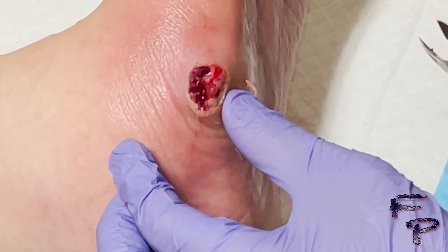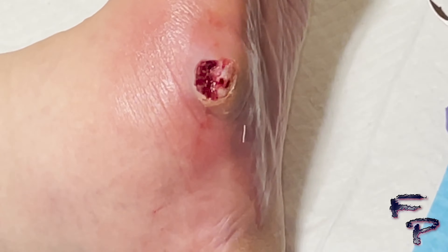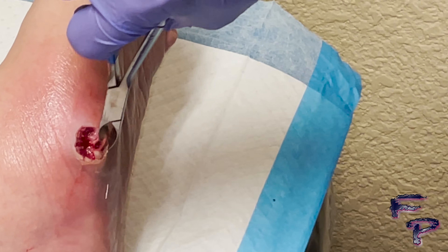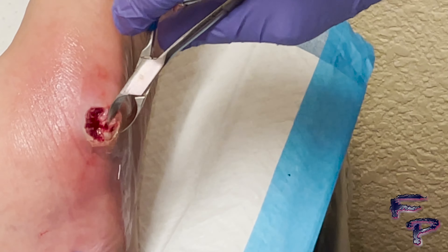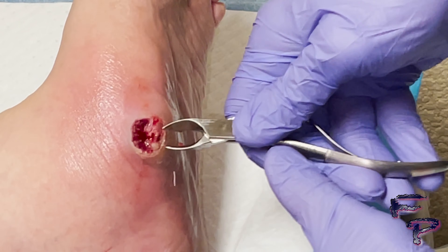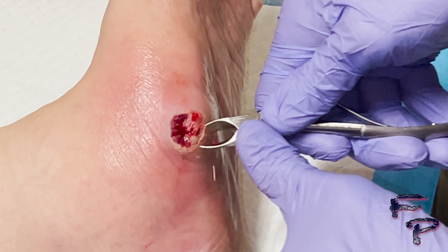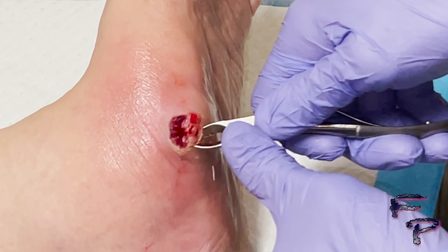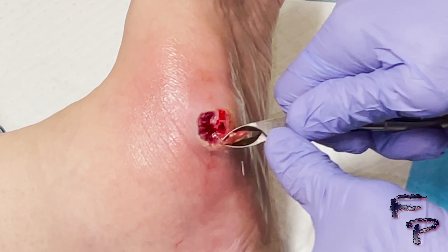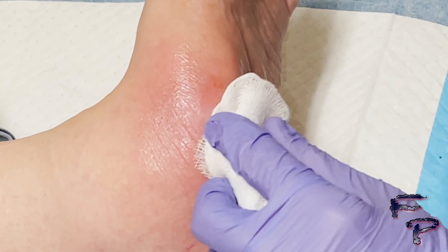You can see that there is still purulent drainage being expressed, which means that there is still loose non-viable tissue in this area. I work my way around starting from this central tunnel, carefully avoiding any vascular structures, working completely around the healthy appearing tissue and debriding and eradicating non-viable tissue.